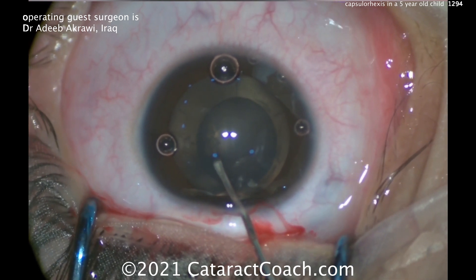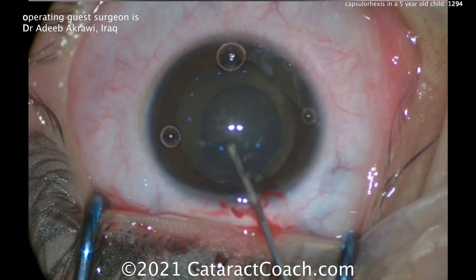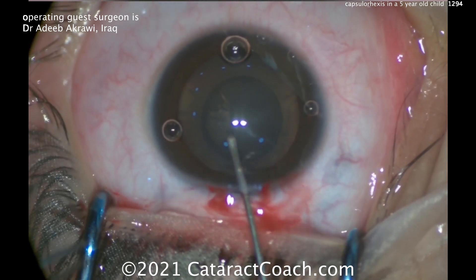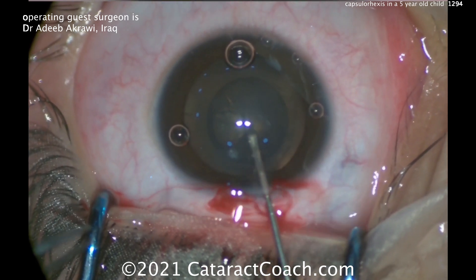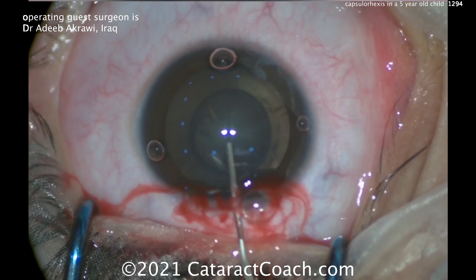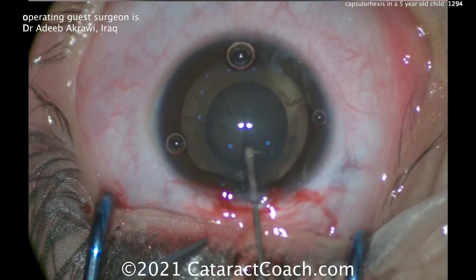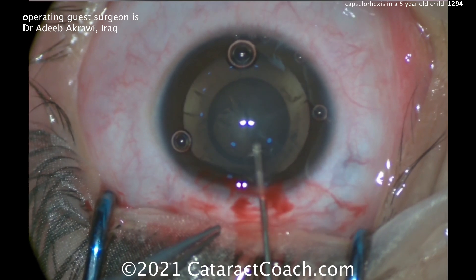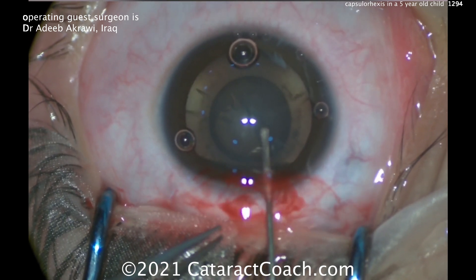He's poking in here on the lens capsule and intentionally trying to start a rexis on the small side, because you know it may go out very quickly. He's actually tracing, which is very smart. This type of lamellar cataract has kind of given that appearance, so he'll put in more viscoelastic. That lamellar cataract is basically about the right size, so he's kind of just tracing the edge of it.